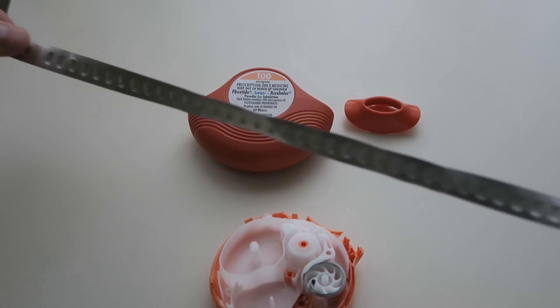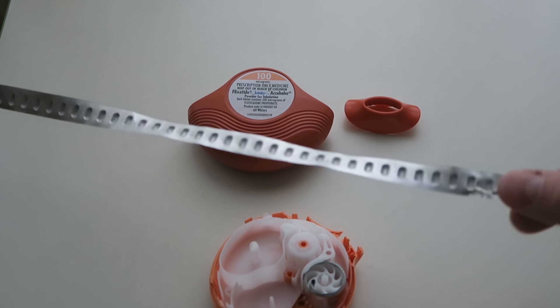Sixty blisters. So that's what sixty blisters on the inside would look like.